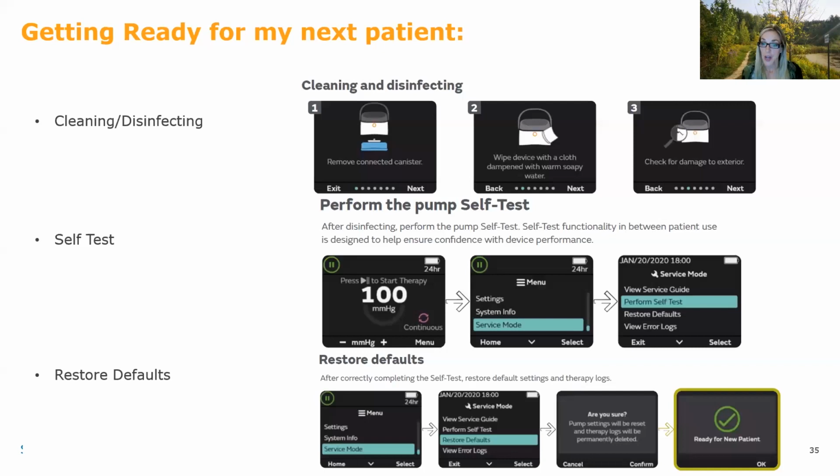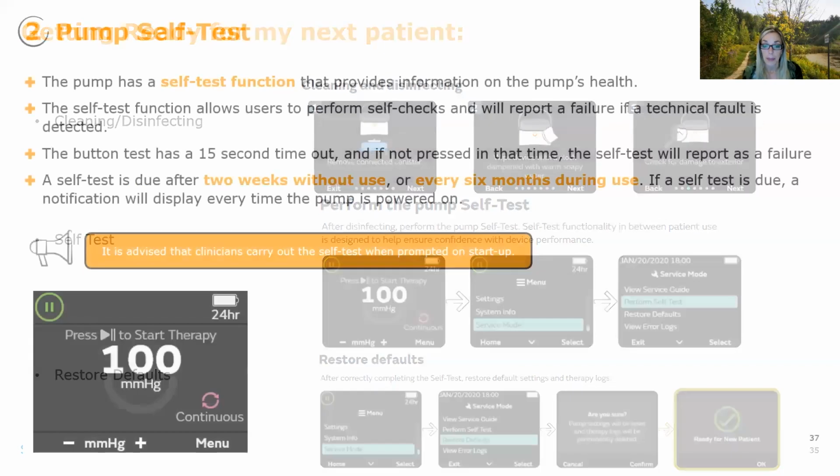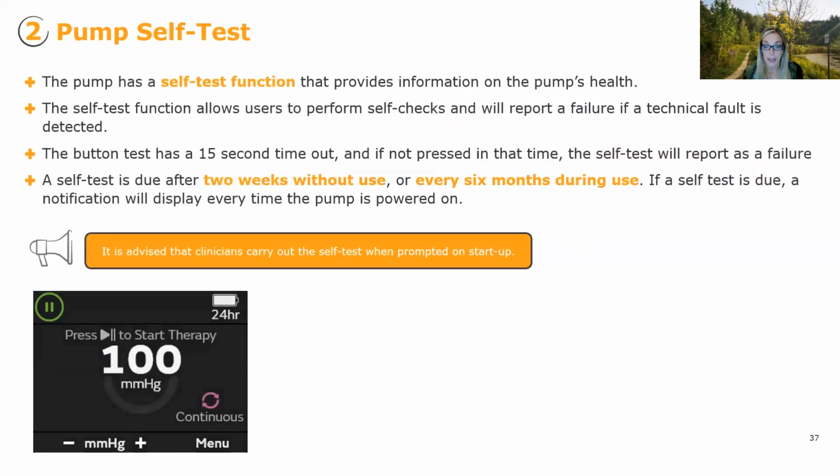I'm thinking, one of the reasons why it's so easy for us in the clinic setting to use Pico is that often we'll keep one or two in the clinic. And if I see somebody come in, I can start them right away. So I'm thinking, wouldn't this be fantastic, to have these on the shelf and be able to start patients right away rather than having to go through the whole process of getting one ordered and cleaned and back and then calling for pickup. So really nice that way.